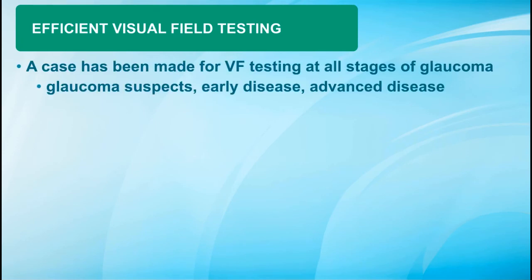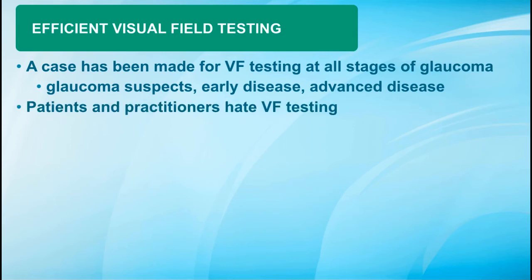Okay. I think I've made a case that visual field testing is important to do at all stages of glaucoma treatment, whether they're glaucoma suspects, whether they have early disease or advanced disease. However, patients and practitioners hate doing visual field testing. I joke with my patients that the worst part of glaucoma is not going blind, but doing visual field tests, and the patients laugh at that because they know it's true.